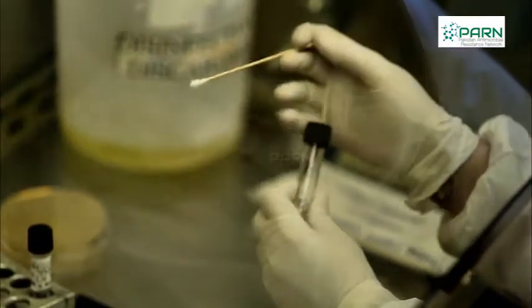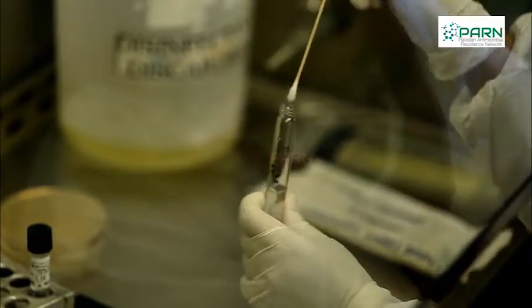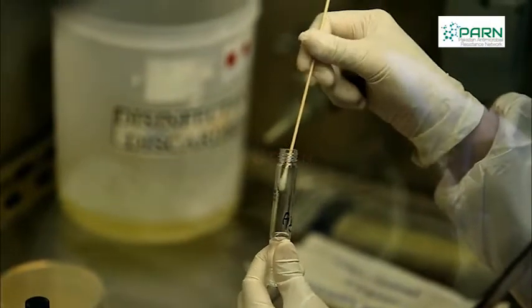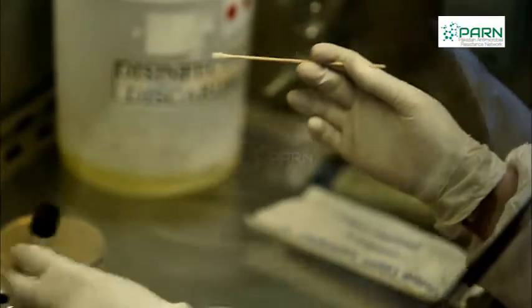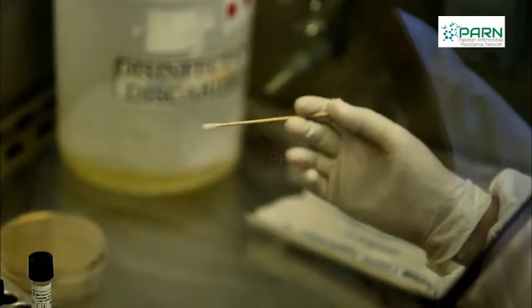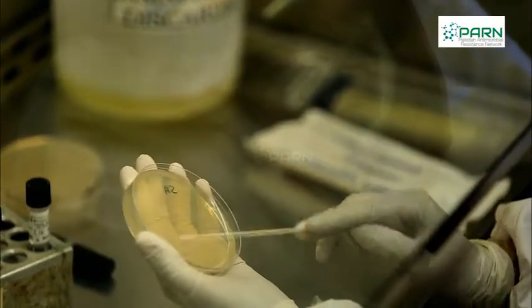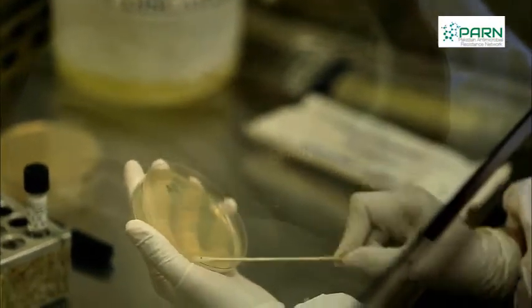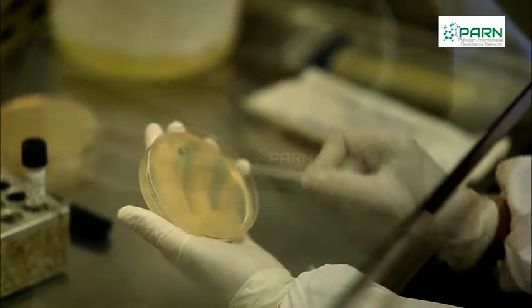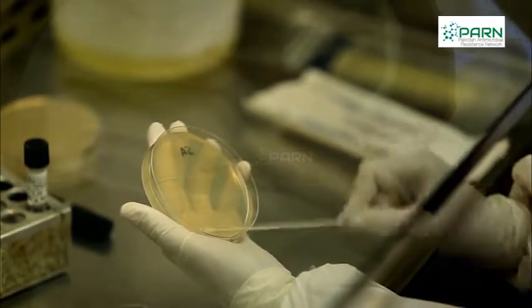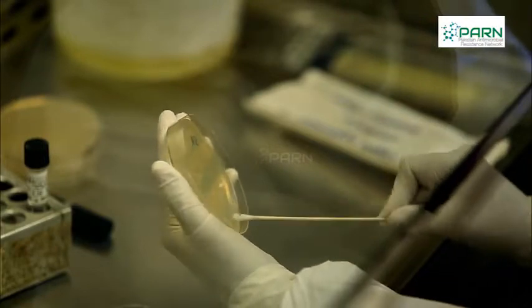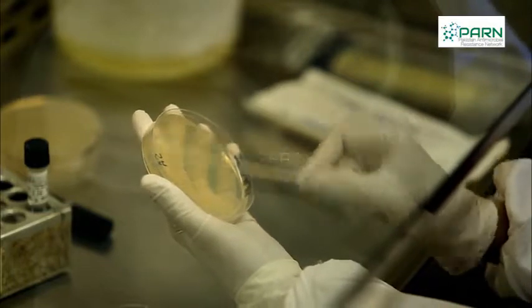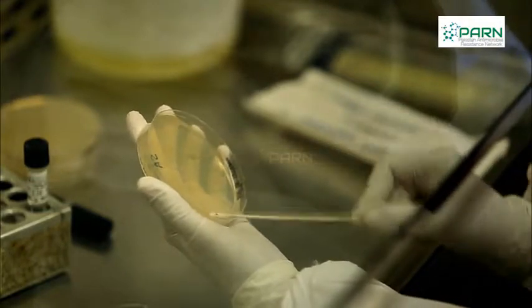Dip a sterile swab into the inoculum tube. Remove excess fluid by rotating the swab against the walls of the tube. Inoculate the surface of Mueller-Hinton agar by streaking the swab three times over the entire agar surface, rotating the plate approximately 60 degrees each time to ensure even distribution of inoculum. Then let the agar surface dry.